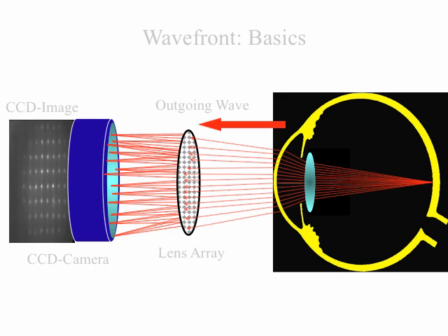Now, imagine that this were not an emmetropic eye, but a myopic eye. And if we illuminate the retina in a myopic eye, then the rays of light are going to emerge from the eye converging. You can think about it for a second. Think about how the far point works, why they must be coming out of the eye converging. Anyway, the front of the eye has too much plus power. Plus is going to make them converge. There are a lot of ways to think of this, but you realize that the rays of light are converging.